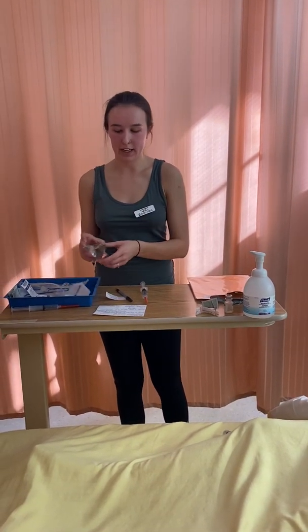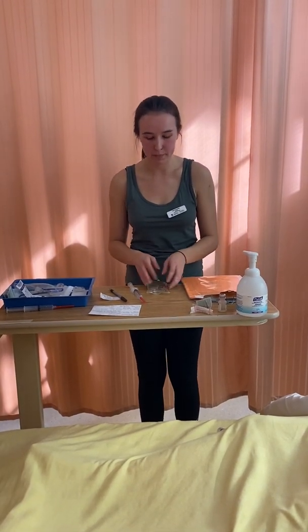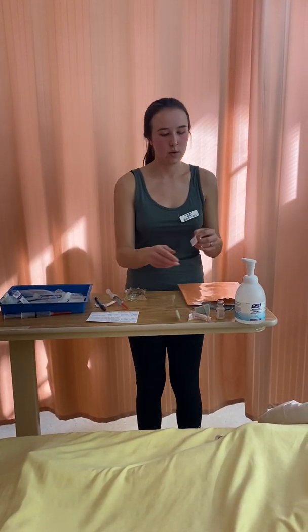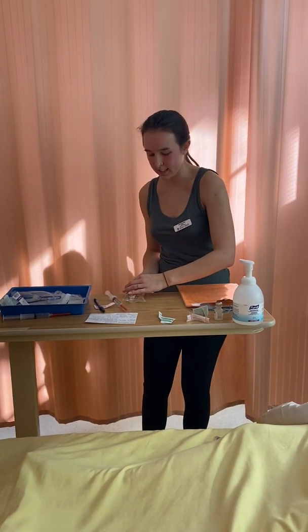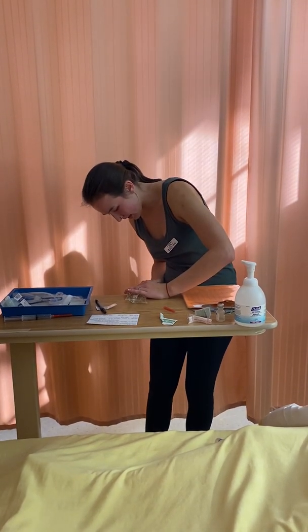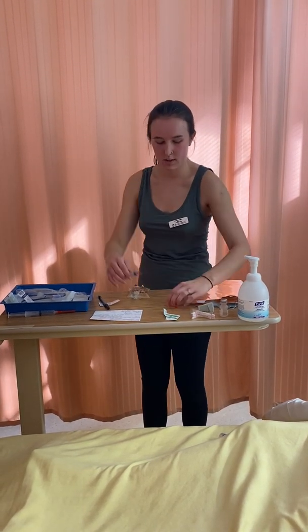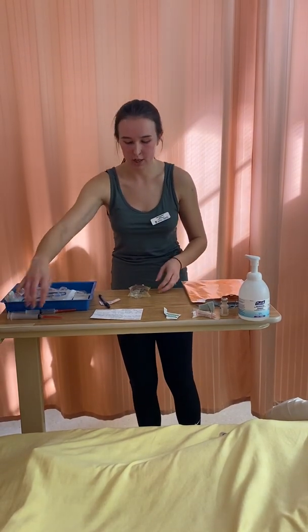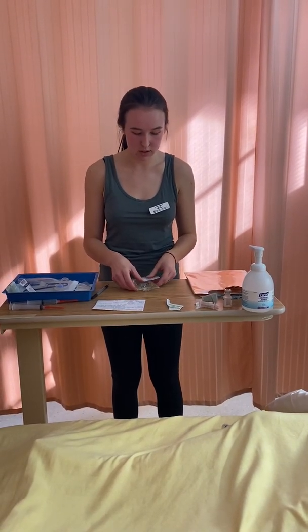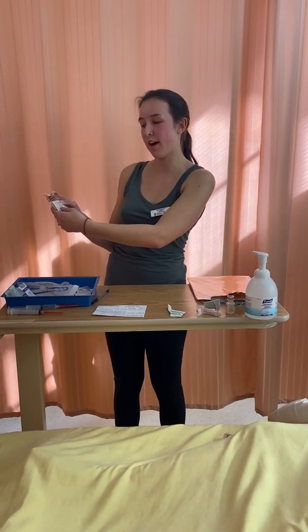I'm going to proceed to diluting my medication. Based on my drug monograph, I need to use a 100ml bag of normal saline. I'll take that out, and with an alcohol swab, I'm going to clean the port for 30 seconds and let it dry for 15. I'm going to remove the cap from my syringe and inject my medication into the center of that port, being careful not to puncture the bag. Once removed, I put the syringe into my sharps container and gently mix the medication. I apply my medication label to the bag, which shows the 100ml of normal saline and the new concentration of 4.5mg per ml.